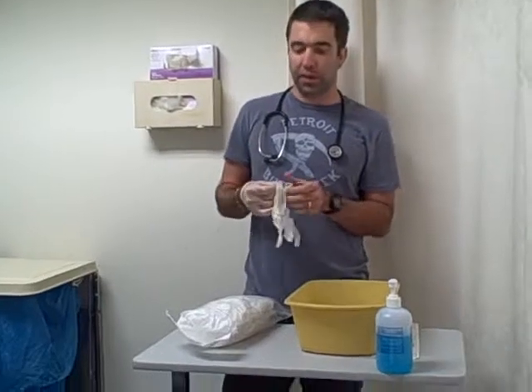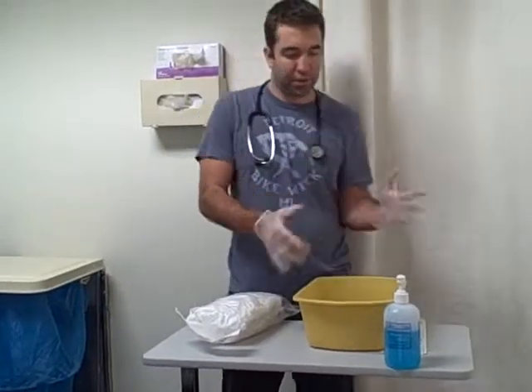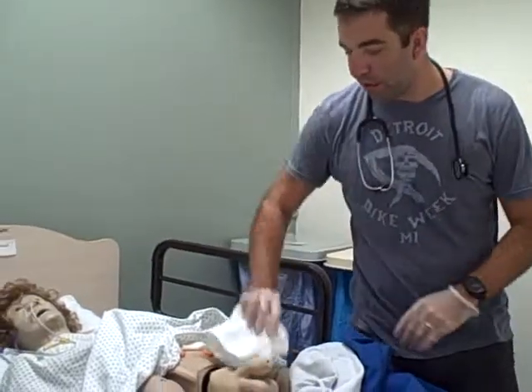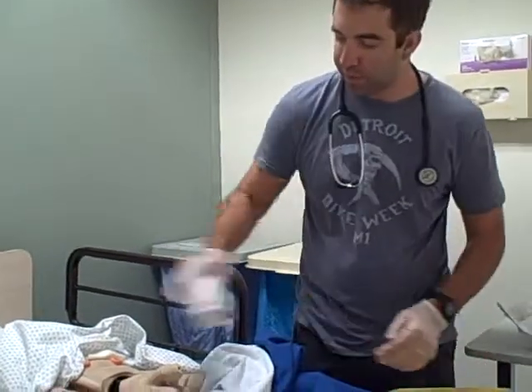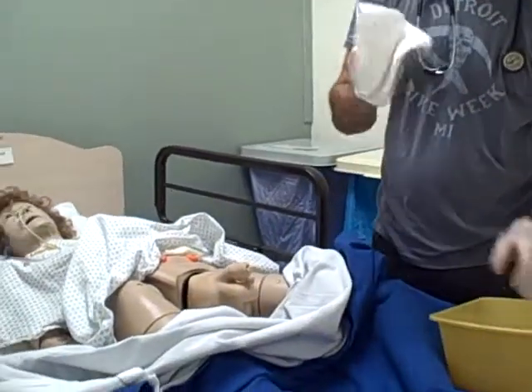So I have my basin here filled with some warm water and some soap. I'm just going to quickly clean the genital area before I do my straight catheter. Make sure that it's clean. Got my washcloth here. Dip it in my water. Clean around the penis, and to the top of it, around the bottom. Clean again, using a different section. And dry off the penis.